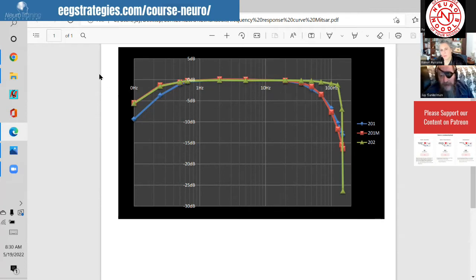And if you take a modern amplifier with a linear response and you force fit it to the database that has an old amplifier that it's built upon, you have to warp this linear amp down to a curvilinear, distorted frequency spectra to match the database. And if you have a database that was built on that amp, you have to match it. So you have to destroy a linear curve to match your database.